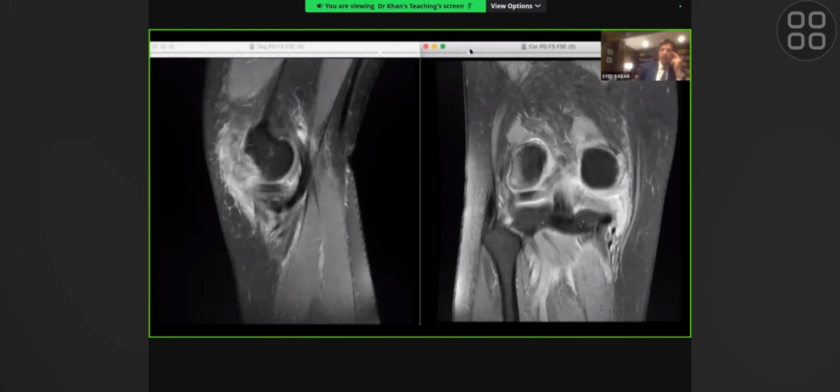Can you point out for the clarity of the people watching? Excellent, very good.